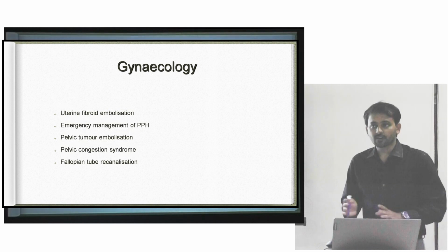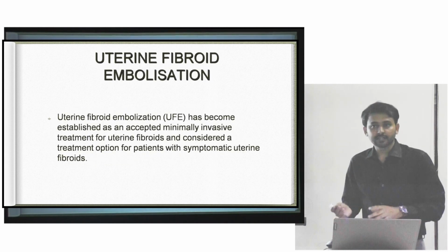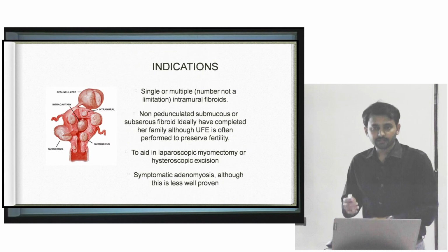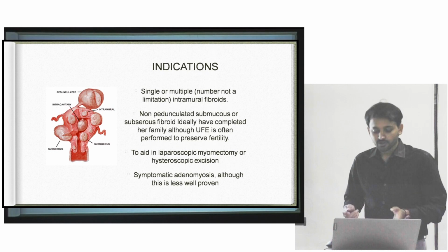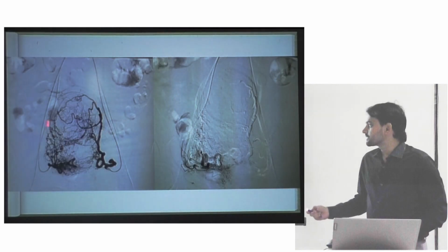So the basic common procedure is uterine artery embolization. For surgically unfit candidates with large fibroids or postpartum hemorrhage, either due to some pseudoaneurysm or some pelvic AV malformation, we used to do uterine artery embolization. So this is one condition. So this is the blush.